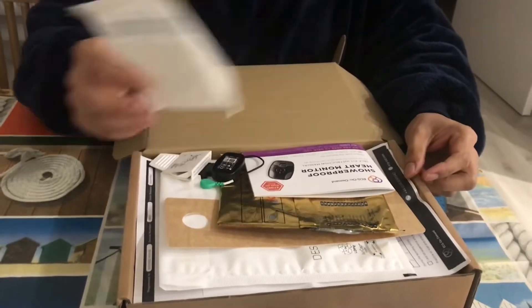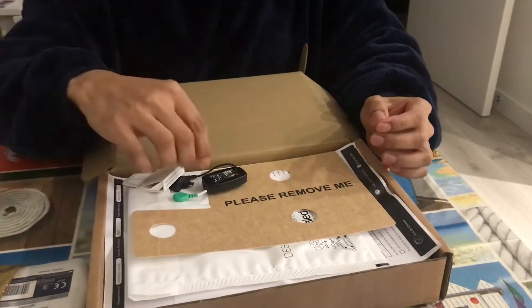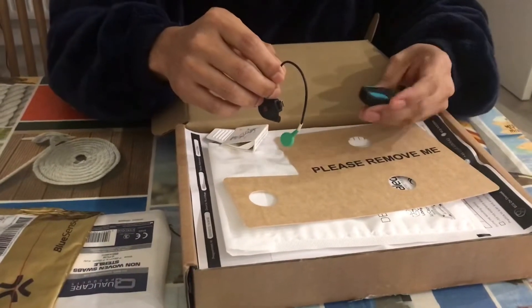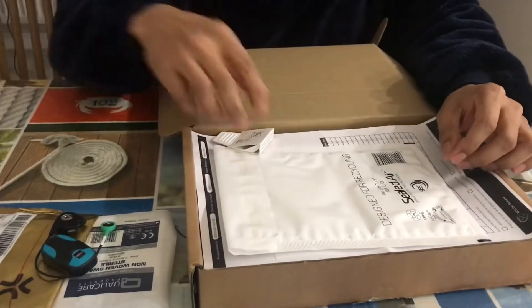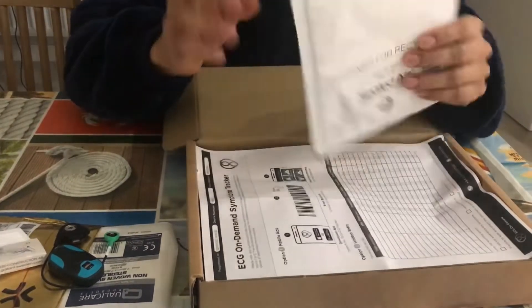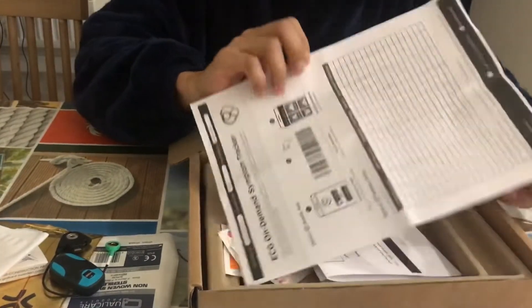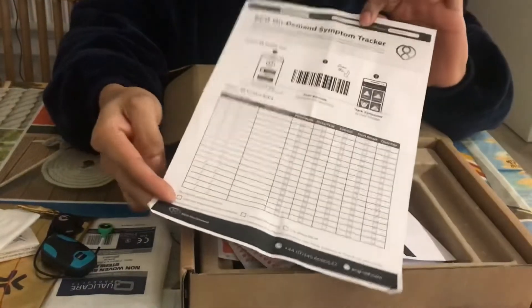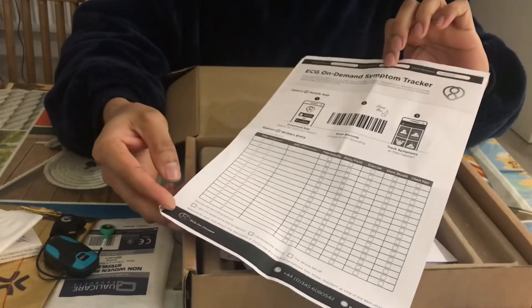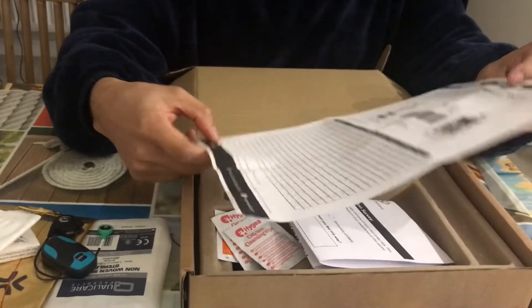It looks like we have ECG on-demand instructions, electrodes, the cable, the machine, and a razor so I can take the hair off from my chest. They have also sent a prepaid envelope so I can send back the machine once I have completed it. There is also a log where you can record anything, or alternatively you can download their app, which I believe is more efficient.